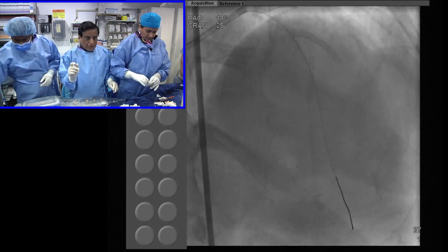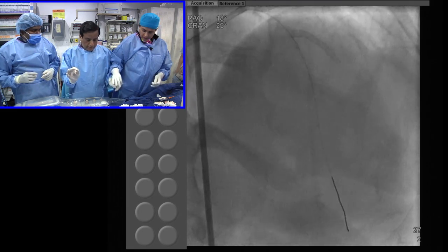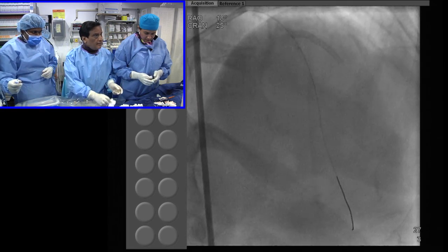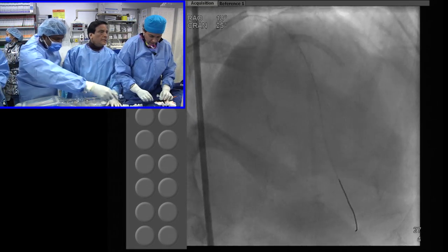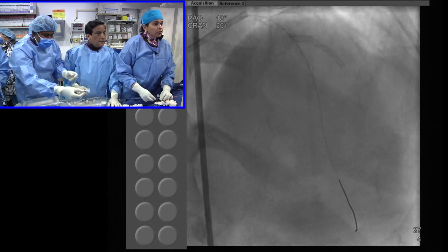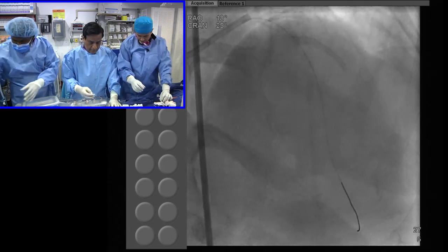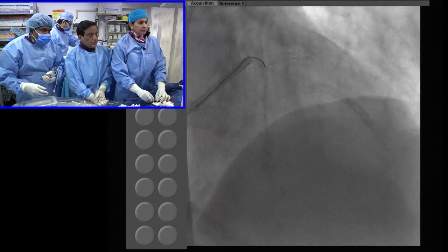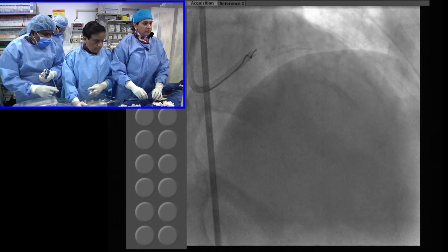So your post dilatation balloon could be 1 millimeter outside those platinum markers. So you see it here. If you can do a cine again once. Now you see the proximal marker and distal marker. A stent boost can also be pretty useful. Yes, that is true. The markers can be seen pretty well.